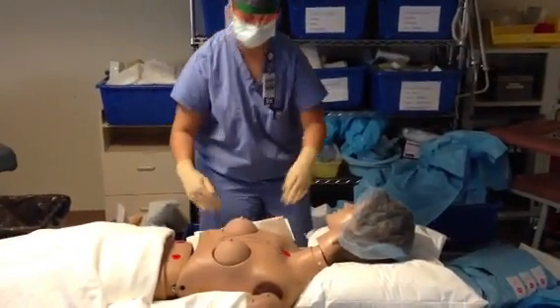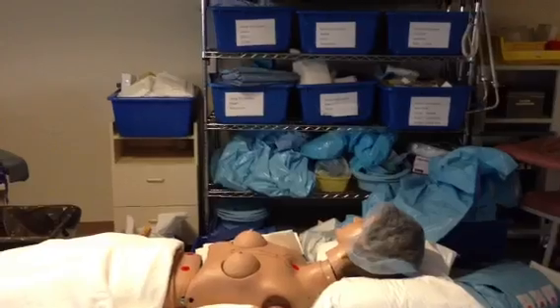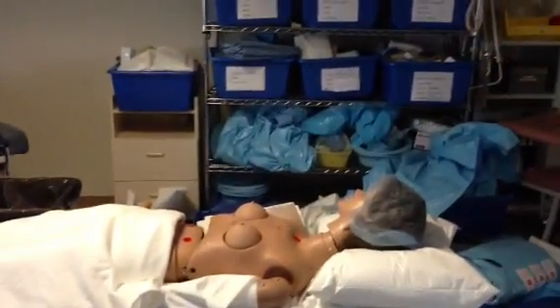Today we are going to show you how to prep the patient's skin for surgery with betadine scrub and paint.